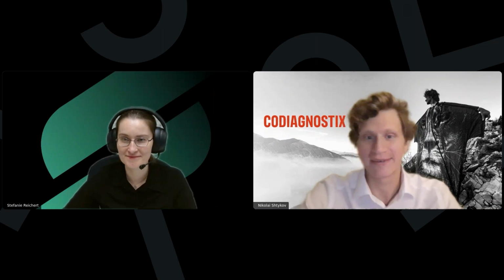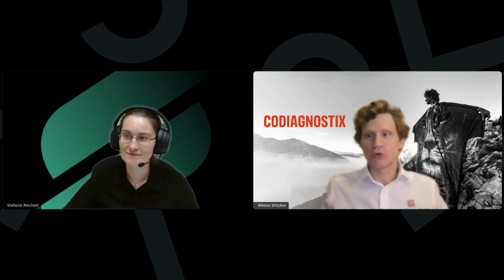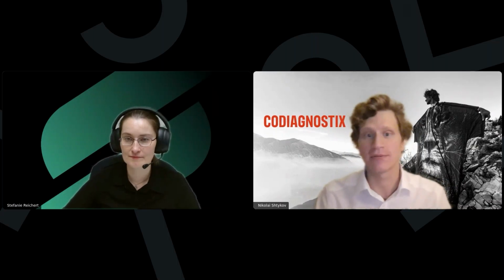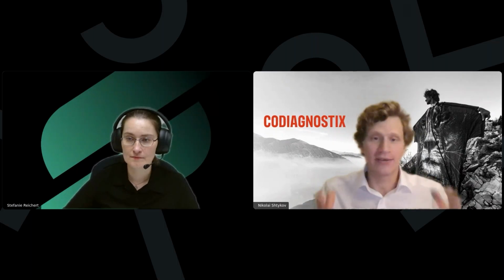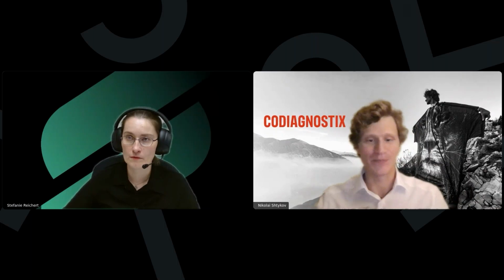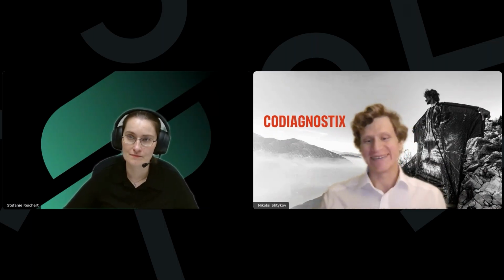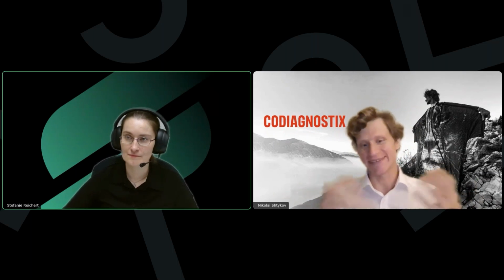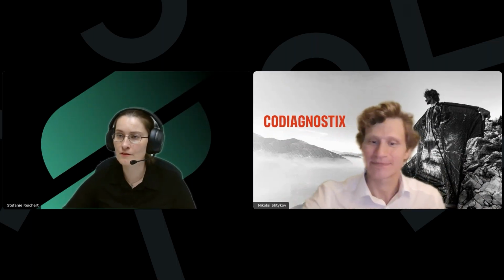Yes, we're a little bit faster. Because I can show you a little bit more in this case, but as we announced for this lecture, it will be about the jaw filling function. And actually, I don't want to repeat, for example, the things I showed in the previous user meetings. But yes, we can do this, of course. But what we wanted to show is the new things, and the new thing is the jaw filling function. So there's a question coming in.